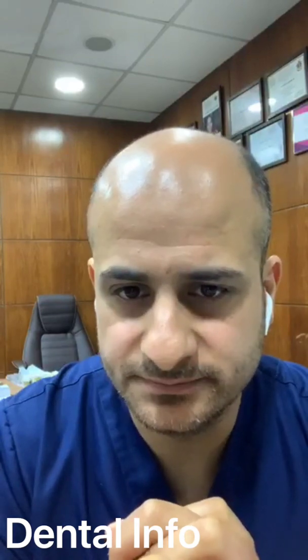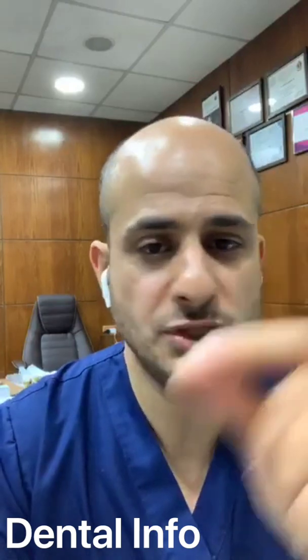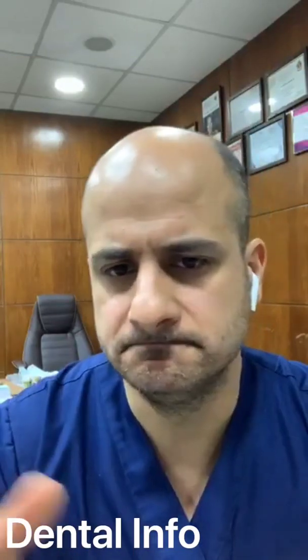Dr. Yusuf Jitawi is asking, Dr. Muhannad, thank you very much. If sodium hypochlorite comes in contact with the sealer, it will affect its activity because of the difference in acidity. Okay, but you have to dry your canal well. Of course, you cannot guarantee that the canal is 100% dry, but you put your cone in and take it out, and the cone is dry. If there is any sodium hypochlorite penetrating in the tubules or the walls, I don't think that will affect it negatively or to a high degree.